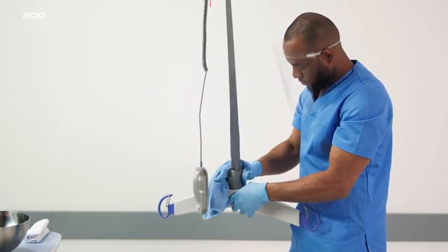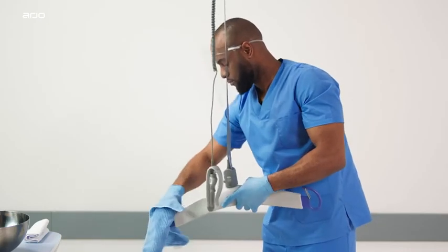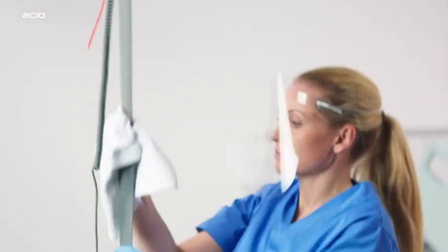Use a clean damp cloth with clear water to wipe off all spots of cleaning fluids. Then wipe clean with a dry cloth.